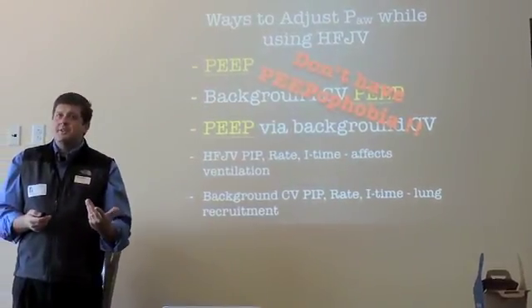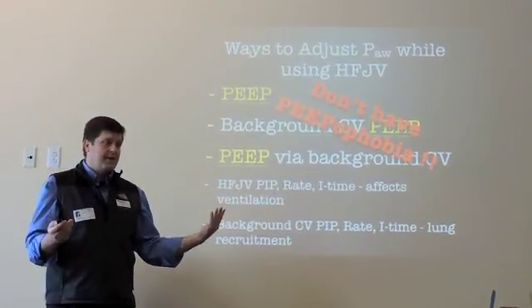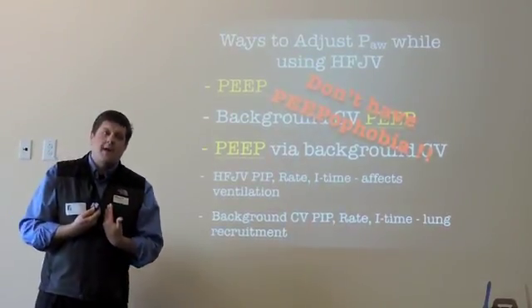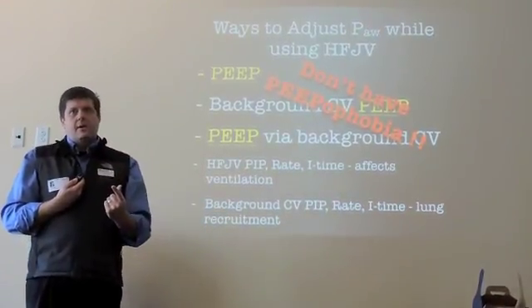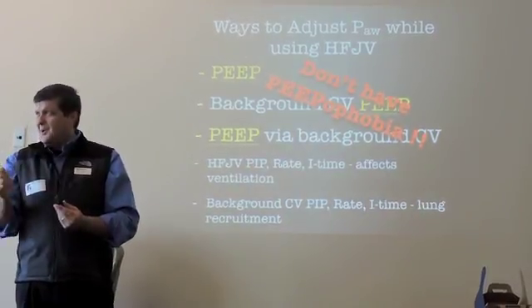Because the next question is how high is too high of PEEP? Is 12 too high? 13? No, there's no number. It's the effect. When you get to the point of hemodynamic compromise, then you've gone too high in your PEEP. But you have to let the baby tell you that. You're more afraid to turn that knob from 9 to 10 than the baby is, I know.